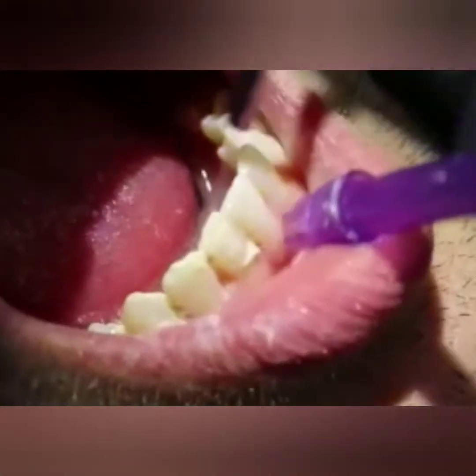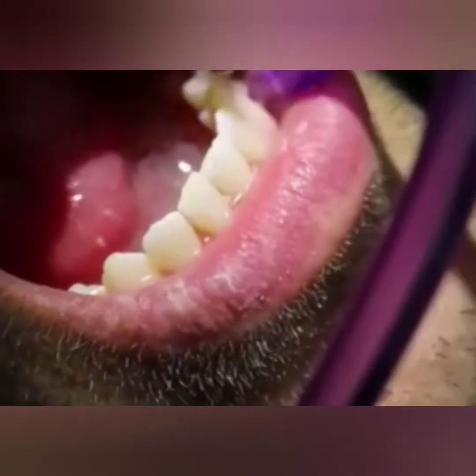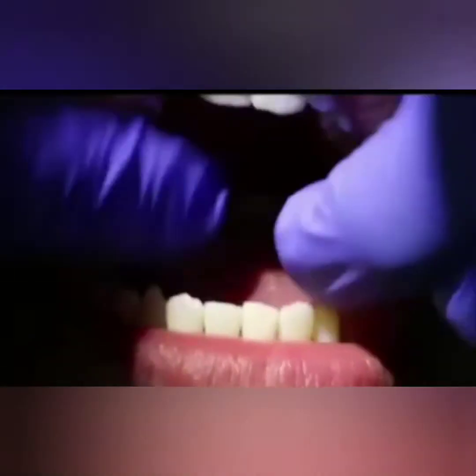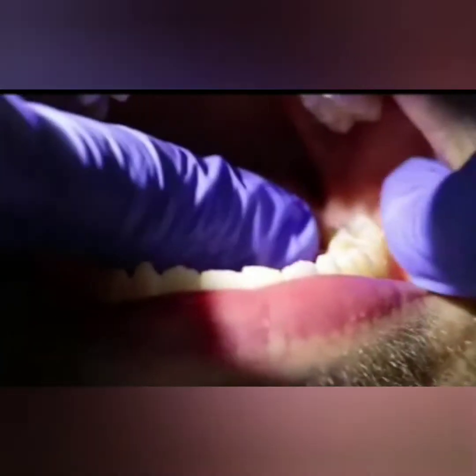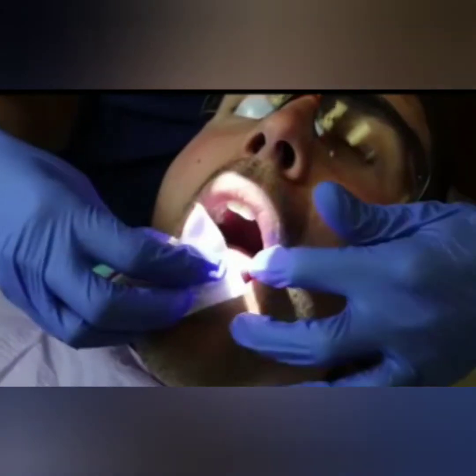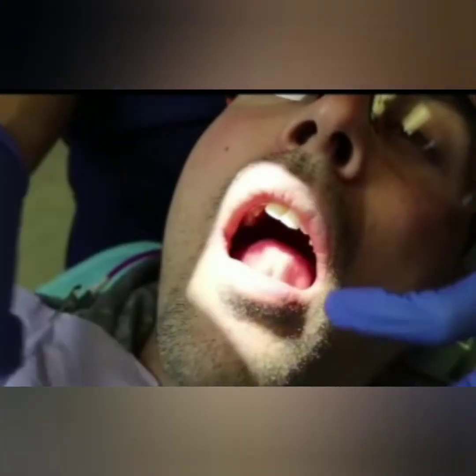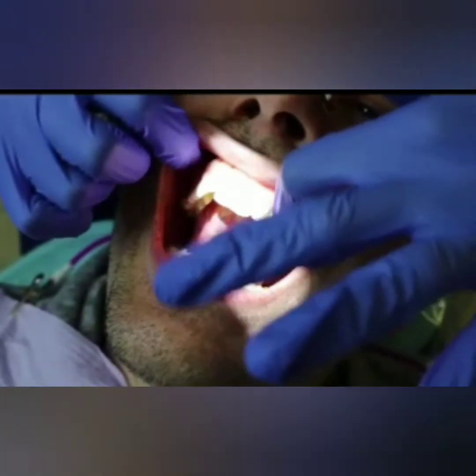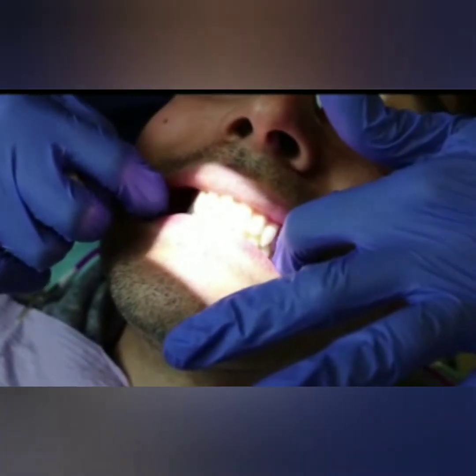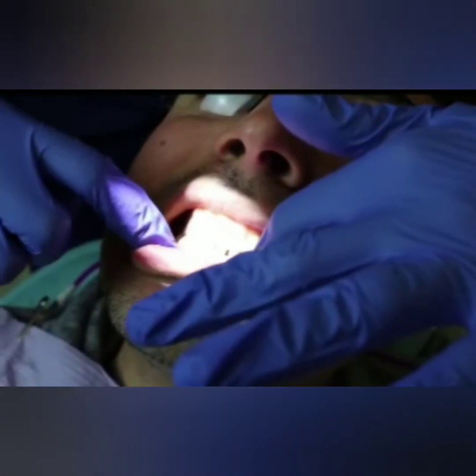In order not to miss any surface, start with tooth 1/8 — the maxillary right side back teeth — then 2/8, the maxillary left side molars, then go to the lower 3/8, and come to 4/8. In that way we cover all maxillary and mandibular teeth. Then do the lingual surfaces. Once scaling is completed, wash thoroughly and do flossing if required.